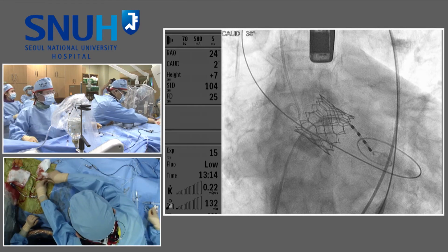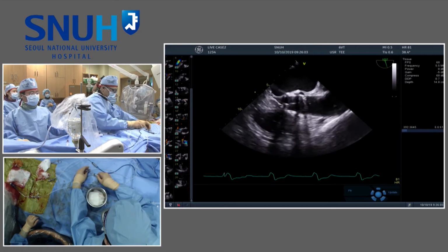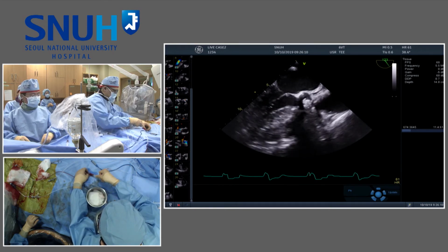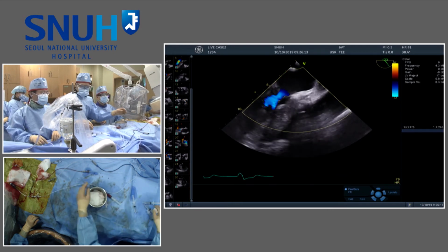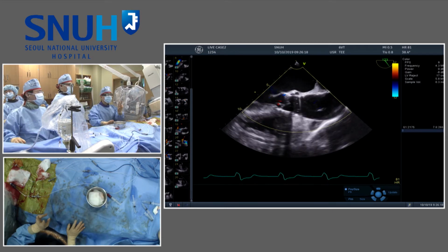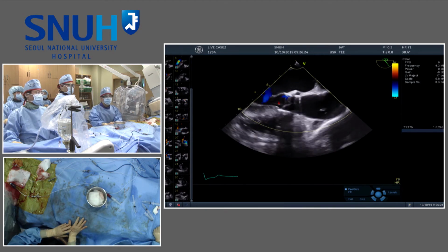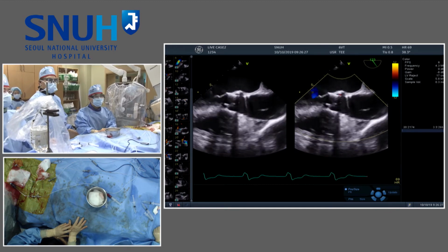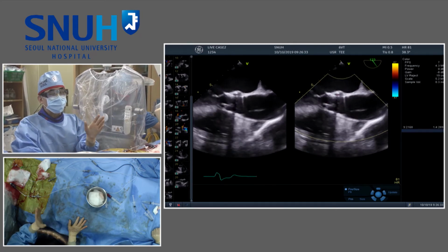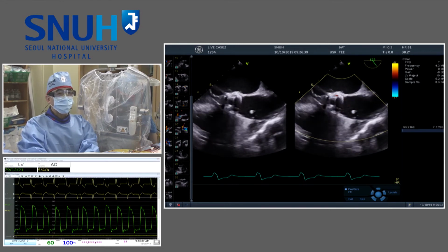Dr. Kim, I have a question. The results are beautiful, very successful. We congratulate you. But there is one issue I don't understand. Why is the patient in general anesthesia with a TEE? Is this your common practice, or is it because it's a live case, or is there any other reason? There are two reasons. Live case, you always request more precise information with good quality of image. Thus, TTE and TEE are totally different. In this case, very complicated. There is a high risk of complication. Thus, real-time monitoring with TEE is really required.